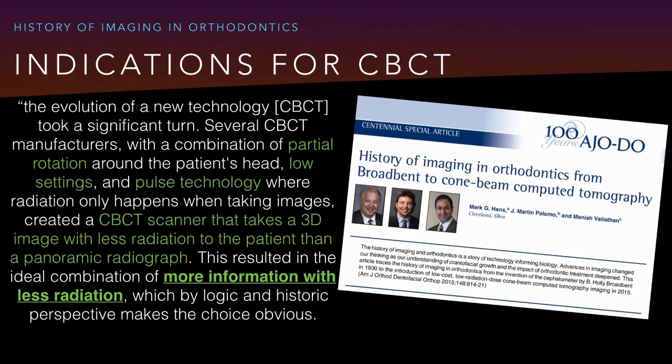And this resulted in the ideal, and again, this is a quote from the article, this isn't me. This resulted in the ideal combination of more information with less radiation, which by logic and historic perspective makes the choice obvious. When I saw this publication, I thought, it's done. This is now the standard of care for orthodontics. They have basically said in a nutshell what I've been saying for a few years now, and I thought, oh, this is amazing. This solves the issue. Everybody's going to adopt this technology.